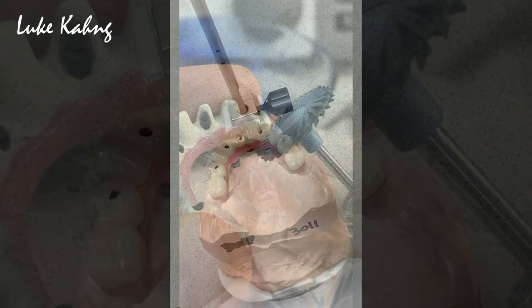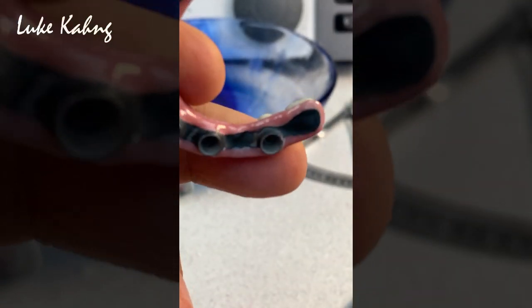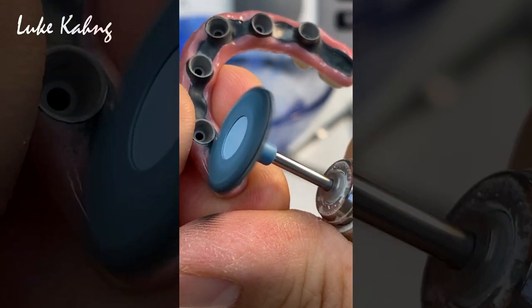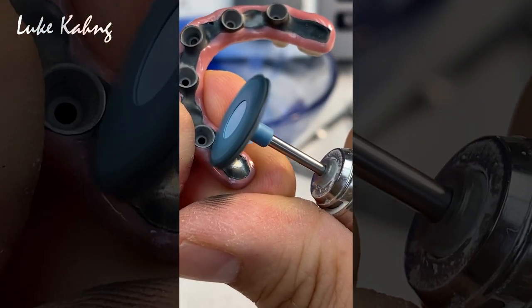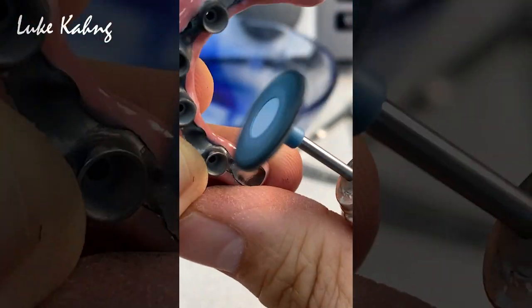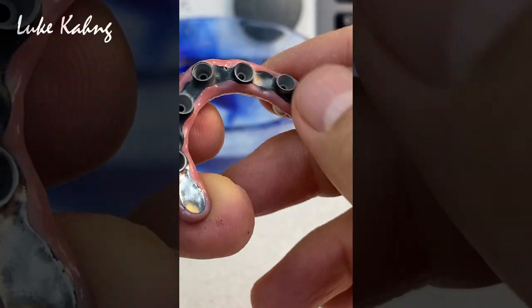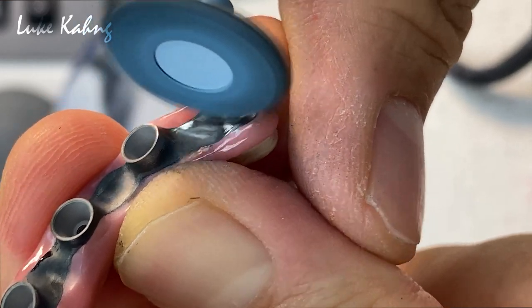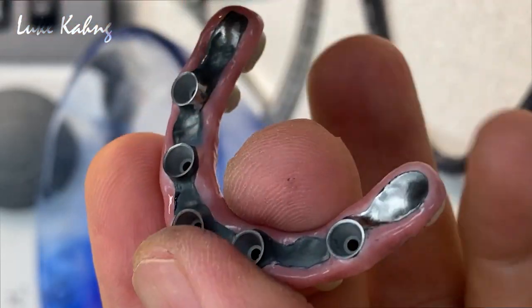All right, thank you. I have to polish because we made really tiny spaces in the lower. So we have to make the metal. Then we can use another polish underneath, which is touching the gum. Here is the smooth polishing after sandblasting, and then all areas we have to polish.